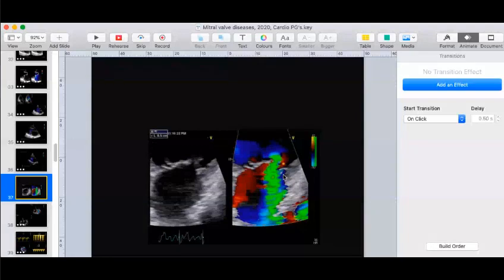What is the advantage of vena contracta? Why is it recommended that it should be used? It indicates the severity, sir. It is used as a parameter to assess severity. But I'm asking a question. This is vena contracta. I'm telling you this is a much better method to assess severity. Why is it better?